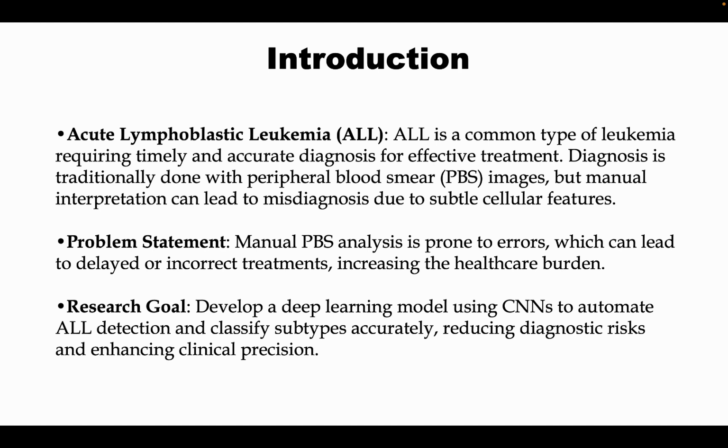Acute lymphoblastic leukemia, or ALL, is a severe blood cancer that primarily affects children and requires precise early diagnosis. Current diagnostic methods rely heavily on peripheral blood smear analysis, which, while essential, depends on manual interpretation. This often leads to misdiagnoses due to subtle visual indicators.